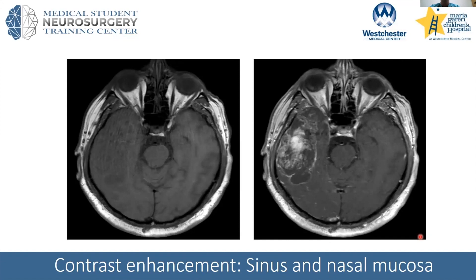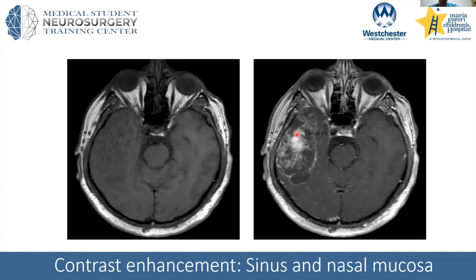Another key MRI feature is contrast enhancement. The patient is given a bolus of gadolinium, a contrast agent that highlights lesions with breakdown of the blood-brain barrier. On the left is a pre-contrast image; on the right is post-contrast — you can see the aggressive lesion lighting up. A useful way to determine whether a scan has contrast: the large veins light up — the sagittal sinus in the back is very bright on post-contrast — and the nasal mucosa also enhances. Sometimes studies get mislabeled, but checking the veins and nose will tell you.